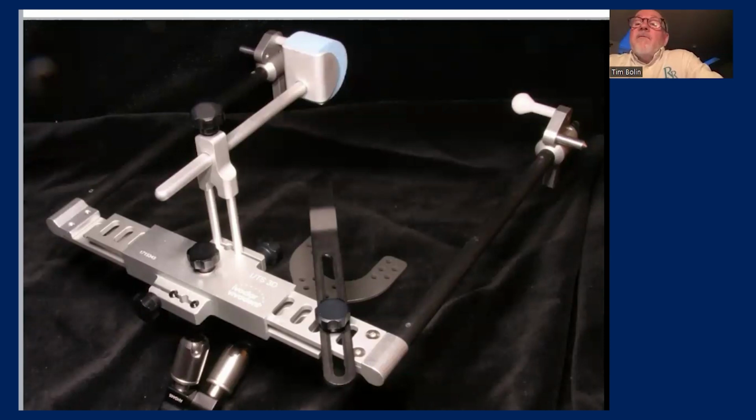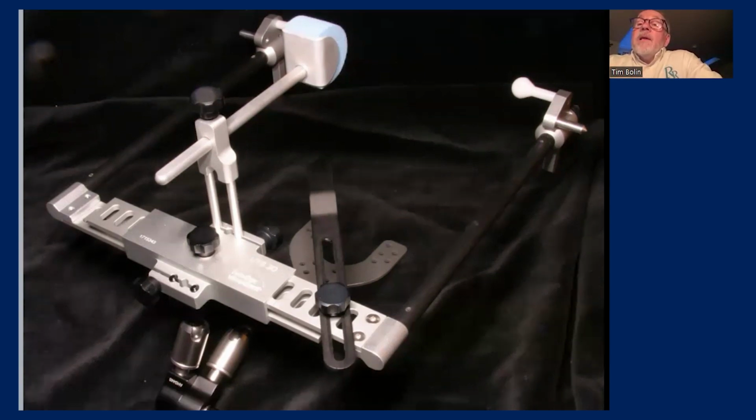Have the patient involved with the case. We're using anterior nasal spine and Orbitale, and I like the indicator there for anterior nasal spine. Now, in this presentation, I'm going to show you ungloved hands. So this is my wife. Nobody was hurt in this production.